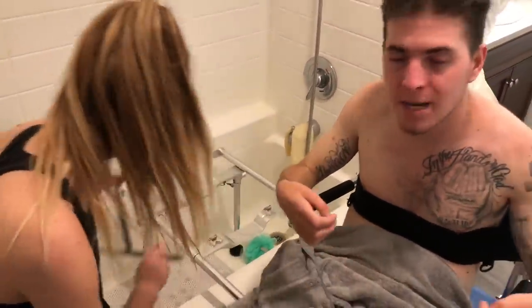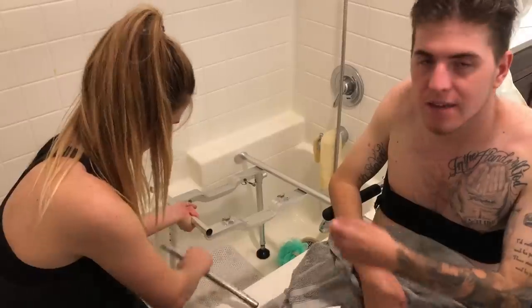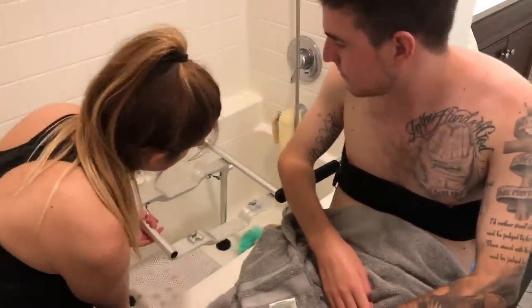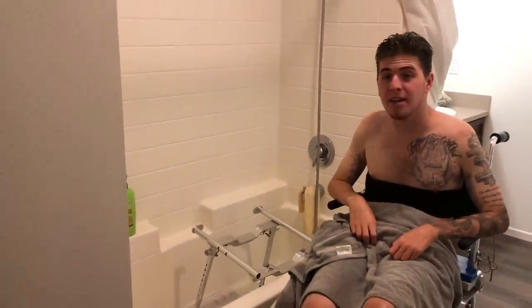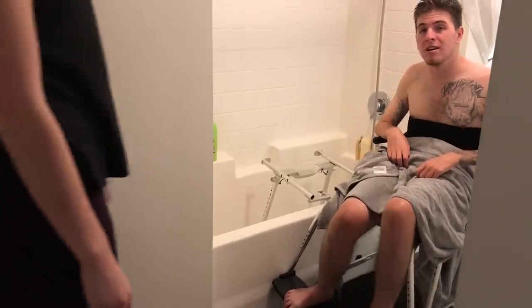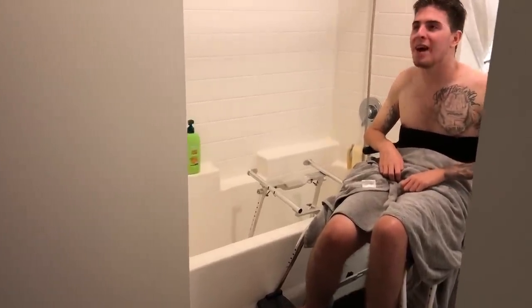Now we're ready to roll back into my room. We'll disconnect this part and I need to just leave this piece in the tub. Like I said, it's a couple of extra steps — sometimes it's harder than others — but it definitely gets the job done and it allows me to be able to shower in a tub. It is a really cool invention and now we are ready to roll back into the room.